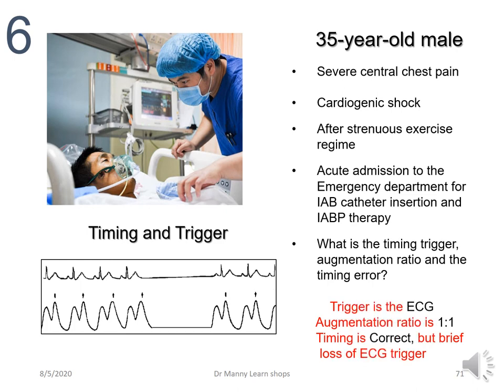The trigger again is the ECG. The augmentation ratio is 1:1. Timing's correct, but there's been a brief loss of the ECG trigger. Maybe the lead came off. And as a consequence of that, the balloon pump, the console, the computer has stopped because it doesn't have a trigger. It needs a trigger in order to recognize inflation and deflation points.